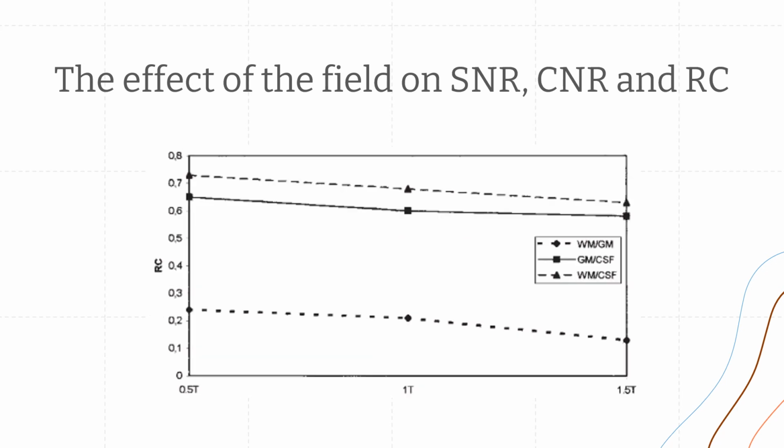Here for the relative contrast, we can see that the relative contrast is less dependent on the field strength and doesn't change so much.